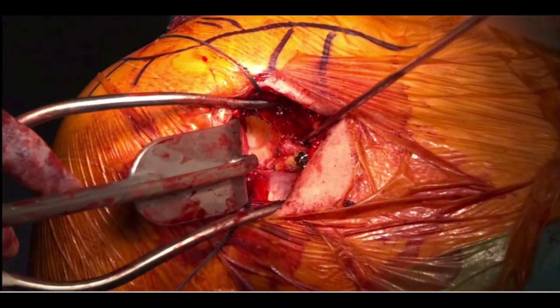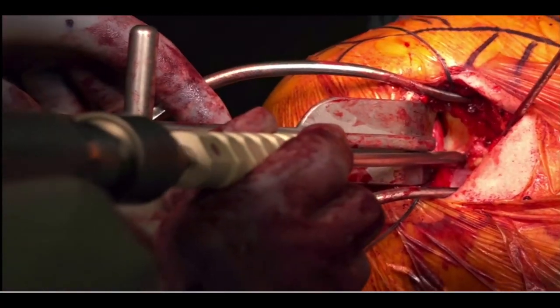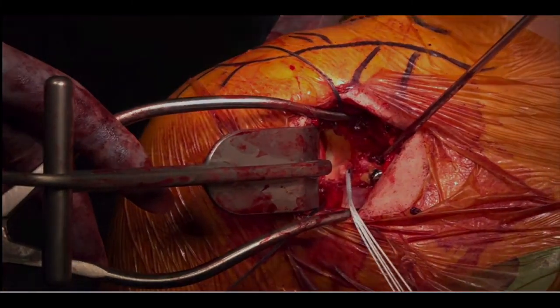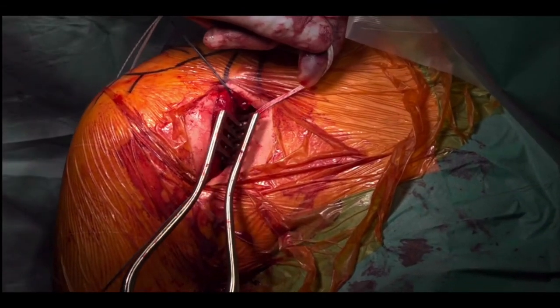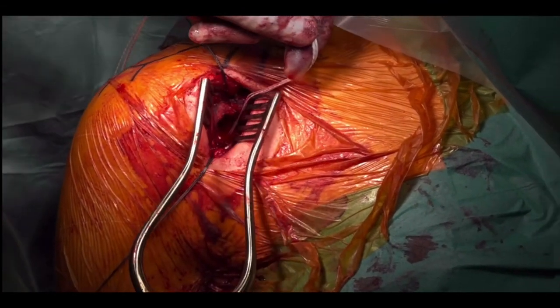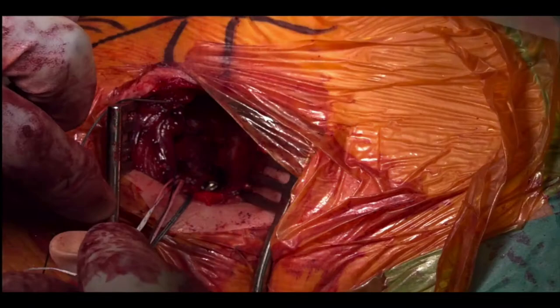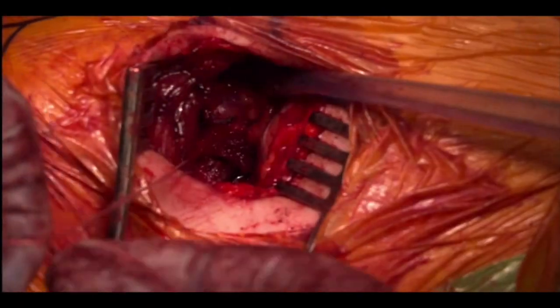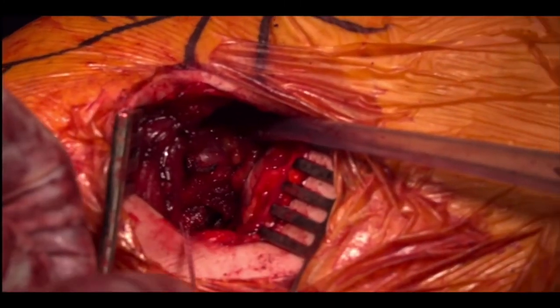An osteoraptor anchor is then inserted on the anterior articular surface of the glenoid just between the two suture buttons. The retractors are removed and the limbs of the suture anchors are shuttled through the stay sutures that were passed through the capsule at the beginning of the case. These are then tied, obtaining a nice extra-articular position for the coracoid graft.